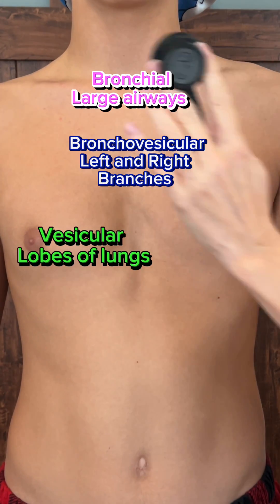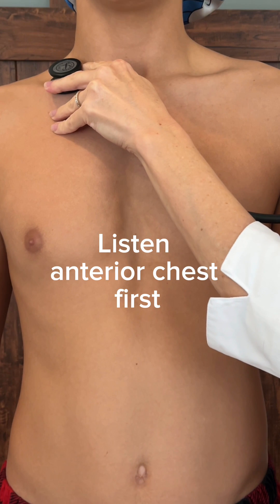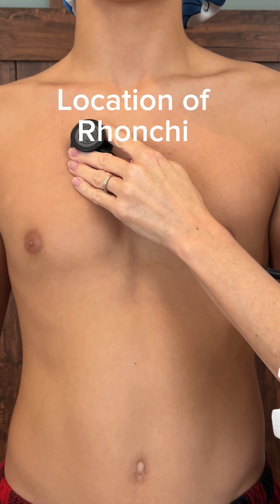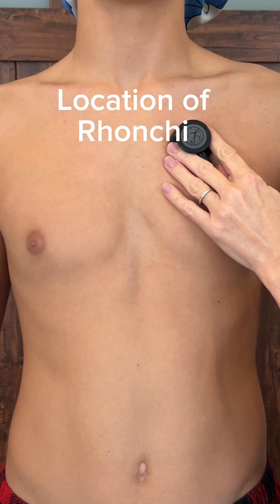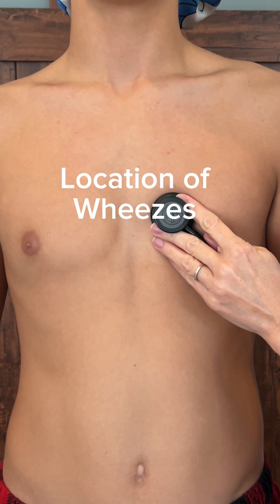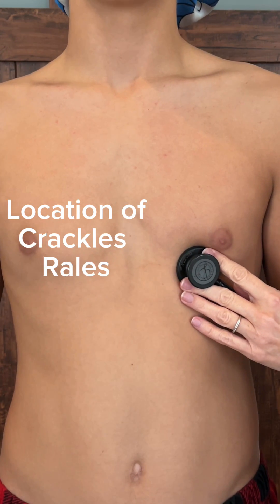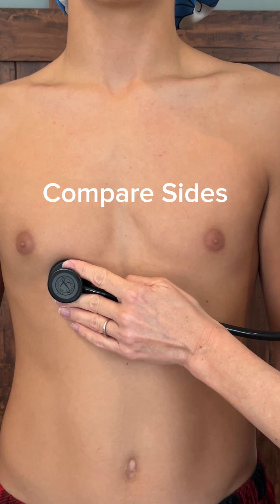Let's talk about auscultation of breath sounds. When you're listening for breath sounds, you want to listen anteriorly first, and then instruct your patient to take a full deep breath in and a full expiratory breath out, and listen to that full breath in each area. As you're doing this, you're going to compare the side you're listening to and then directly go to the opposite side and listen in that same spot, so you can see if there's any difference between that area on the other side.